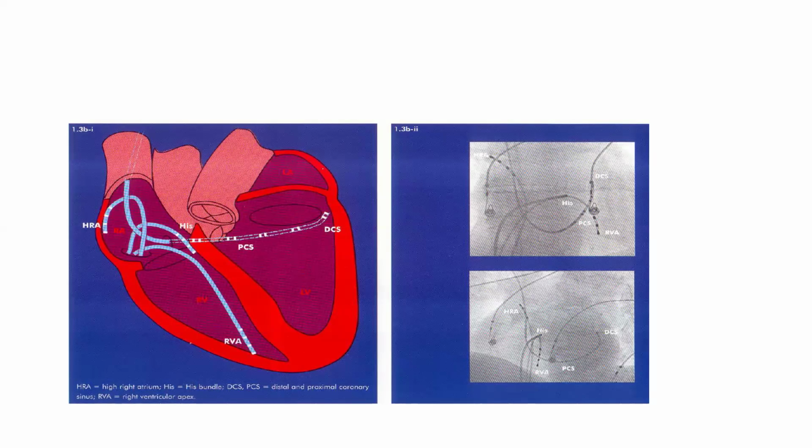So as I said, based on naming, they are both positive and negative electrodes, right? If it is 2, that will be bipolar. If it is 4, tetrapolar. If it's 8, octapolar. If it is 10, decapolar. So it's just the common terminology we use. All right, sir. Thank you, sir.